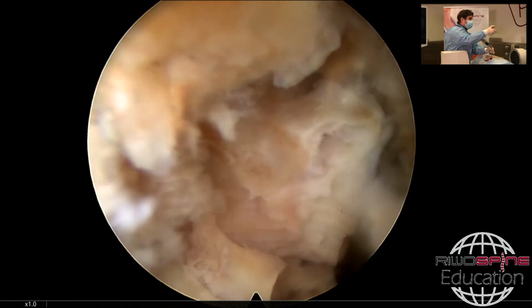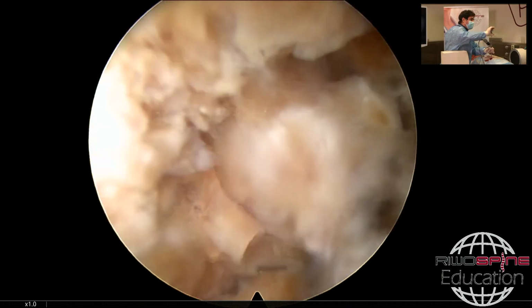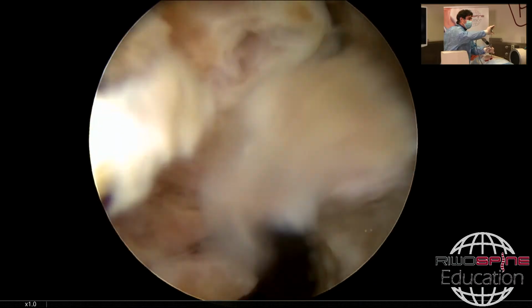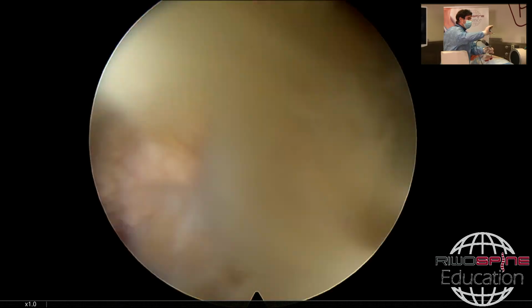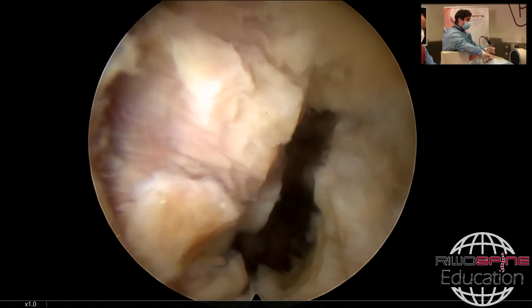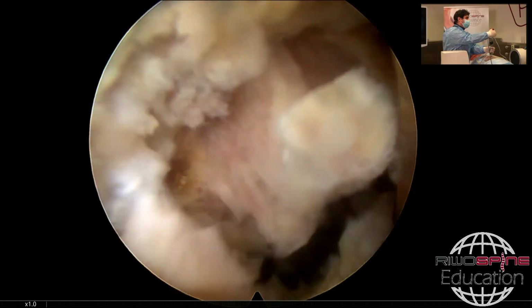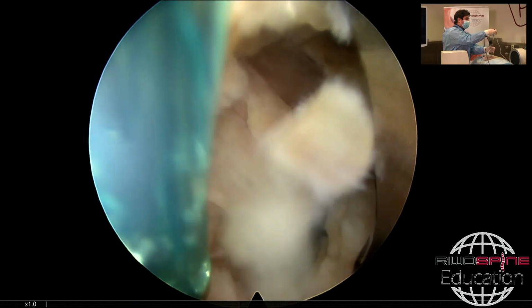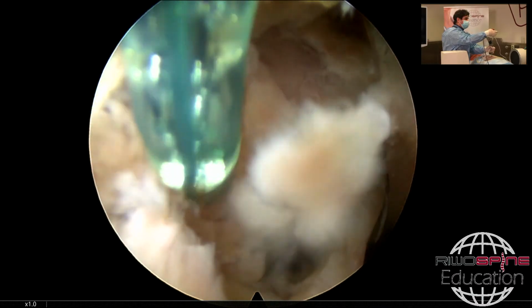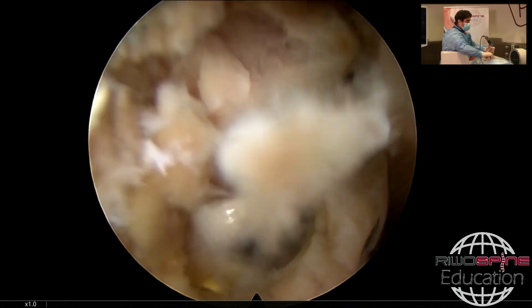Okay, more from the caudal lamina also. Now I just cut the caudal lamina, the upper part of the caudal lamina like that. And then I had the rongeur.